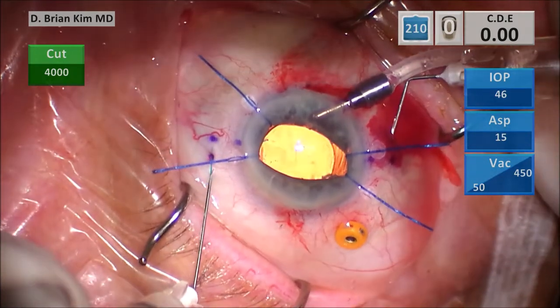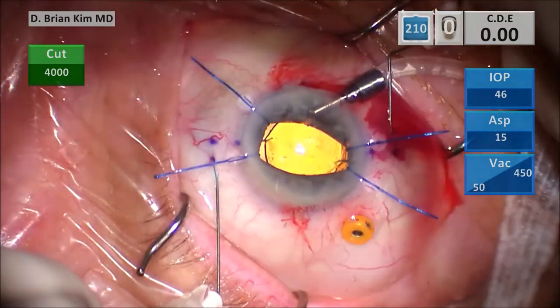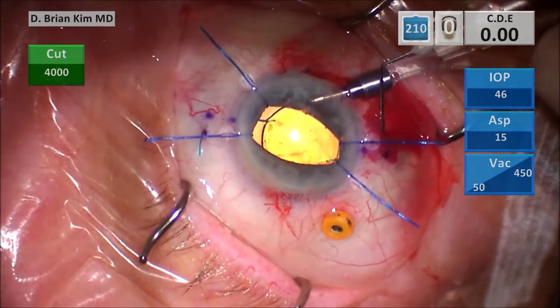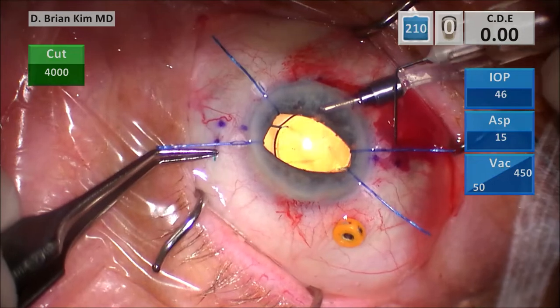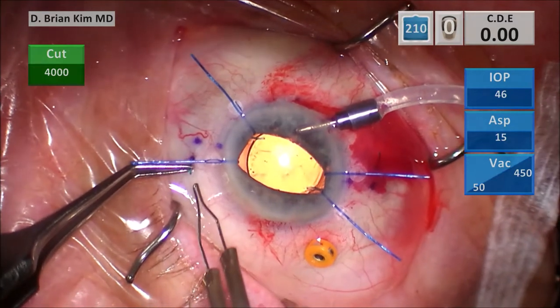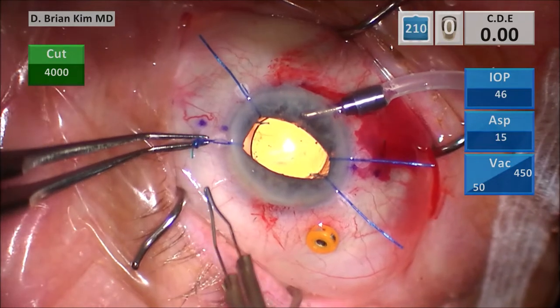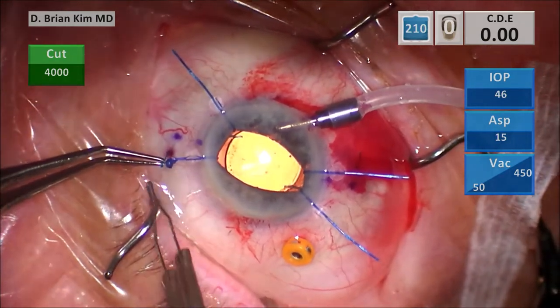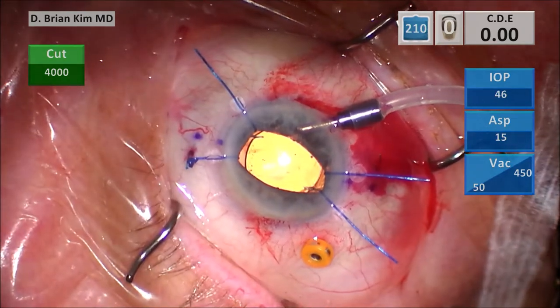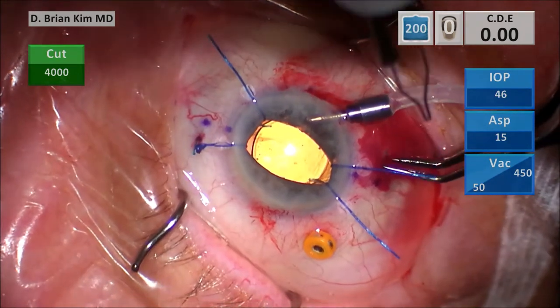With the Sensar lens it's pretty tacky — it has good holdability in the lumen of the needle. As I pull the needle towards me on the left and away from me on the right side, I try to use equal forces, looking at the optic to make sure it's centered. The haptic on the left side came out and it's not retracting — that's the difference between this and the CT Lucia lens, whose haptics tend to slip back in. I'm going to cauterize, but I got the haptic tip and also the iris retractor, so I heated and melted both.